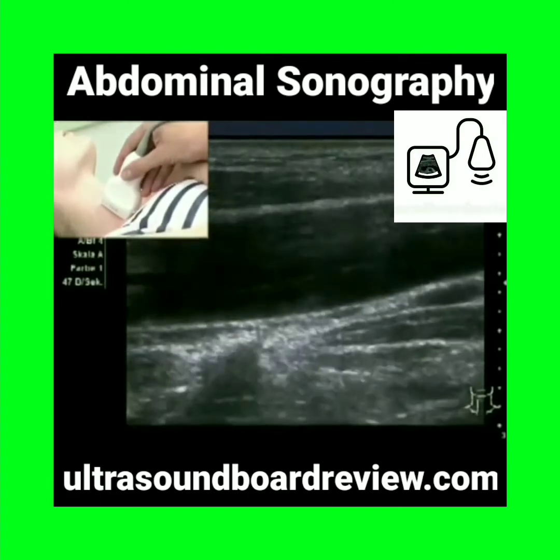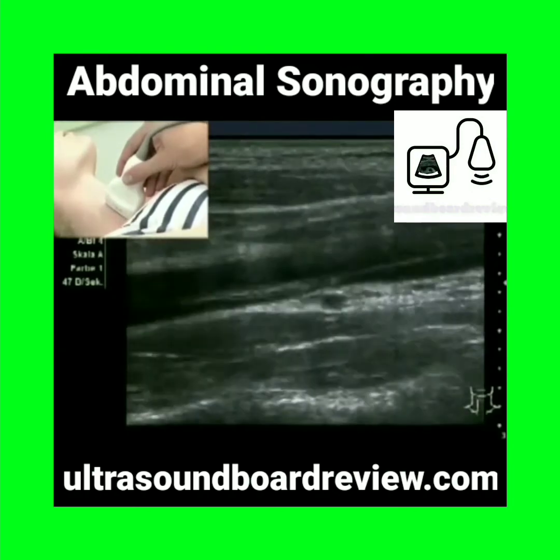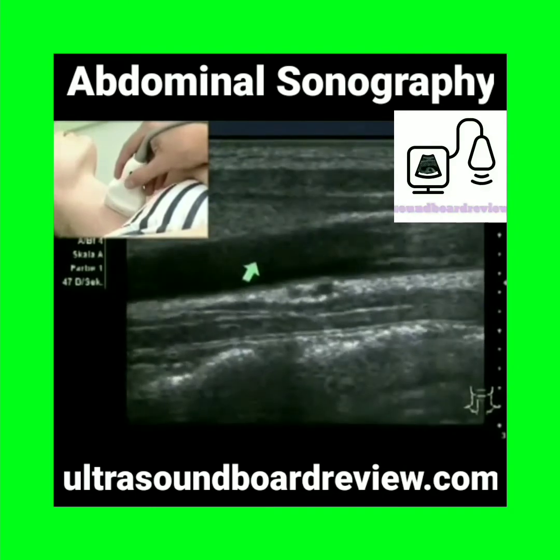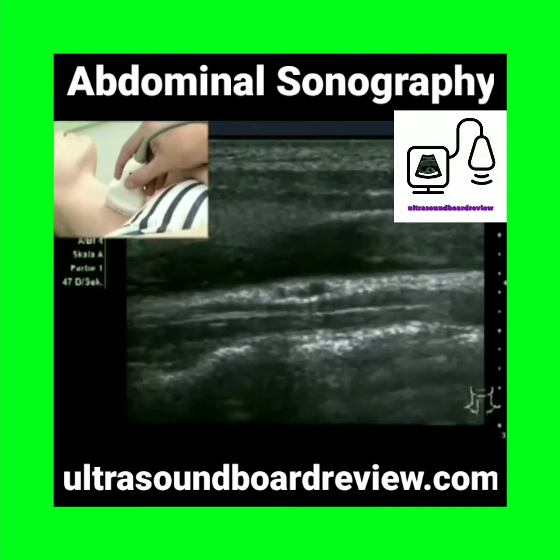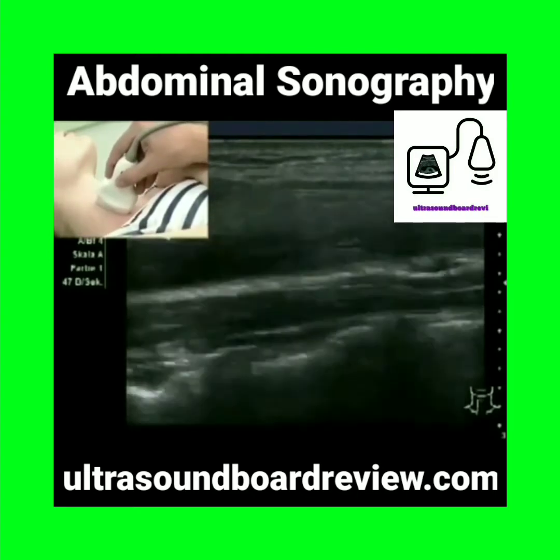Start laterally. Here we see the common carotid artery and already see the first part of the thyroid gland.